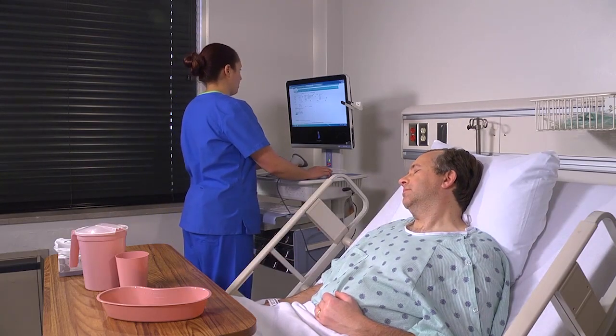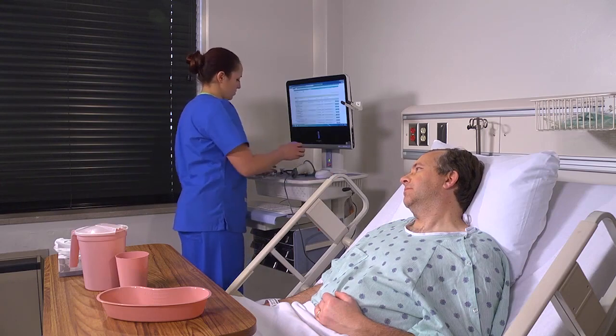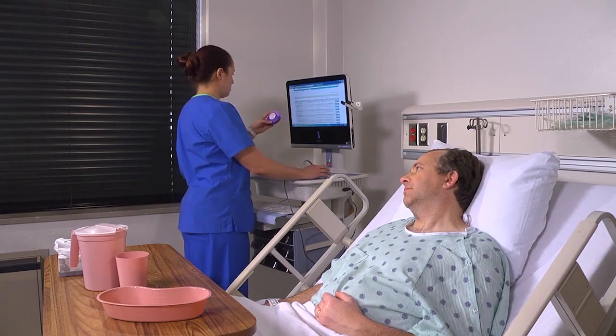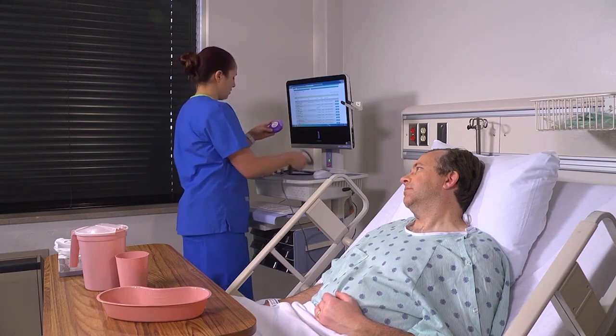Compare the label on the medication with the information in the medication administration record twice when preparing for administration. Do a third check at the bedside. Also check the expiration date of the medication.